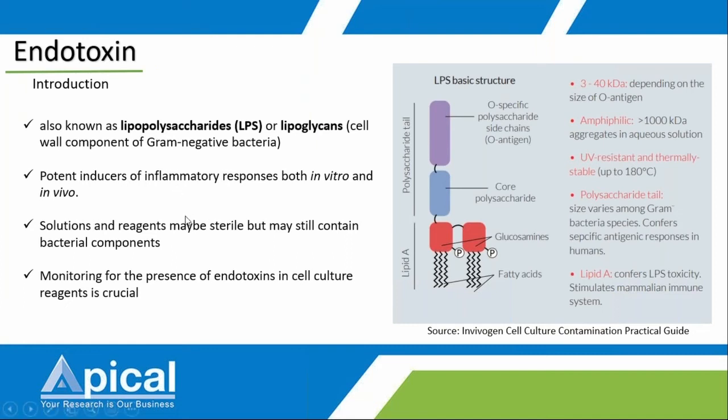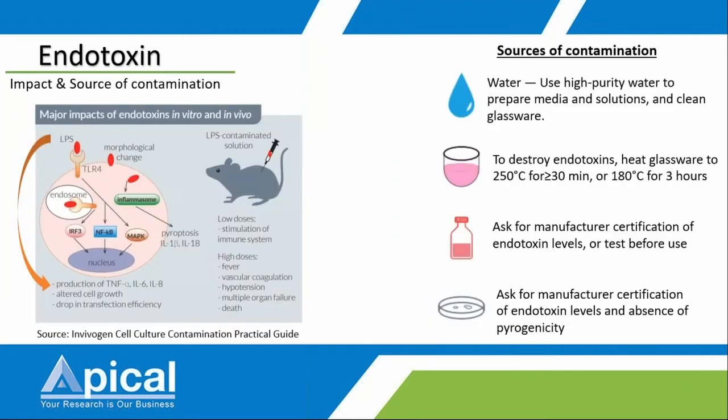All right, so because of that, we are going to look at the impact and source. Now let me bring you through the impact. Endotoxin presence can significantly impact both in vitro and in vivo. This is like how I've explained earlier.